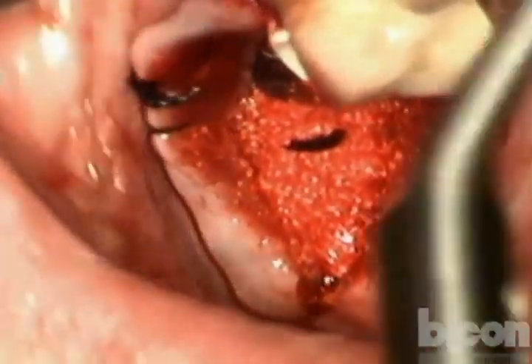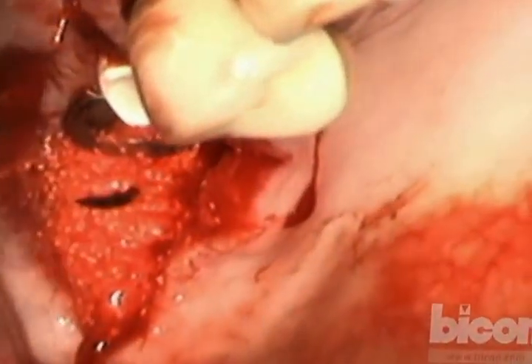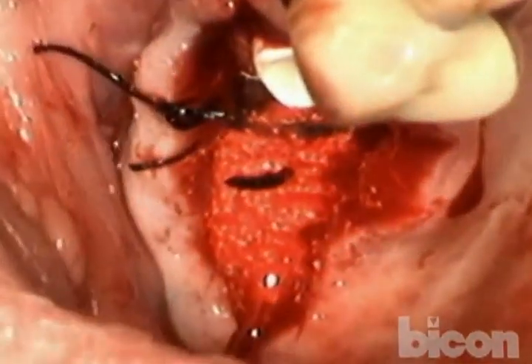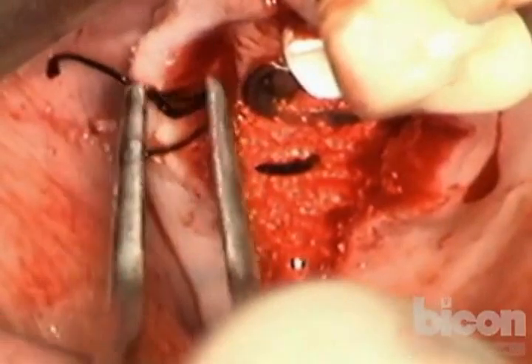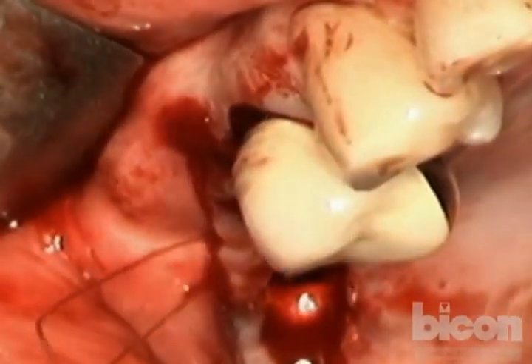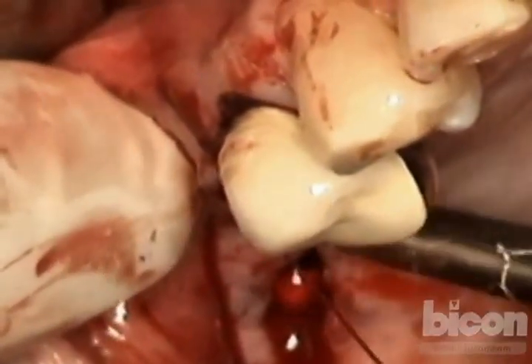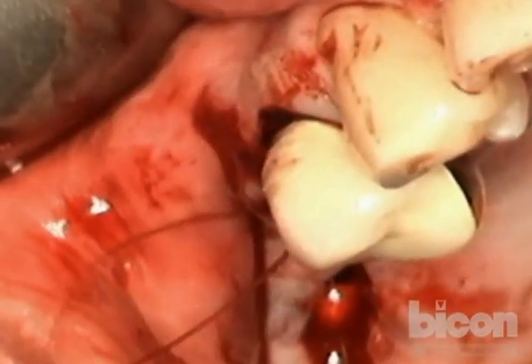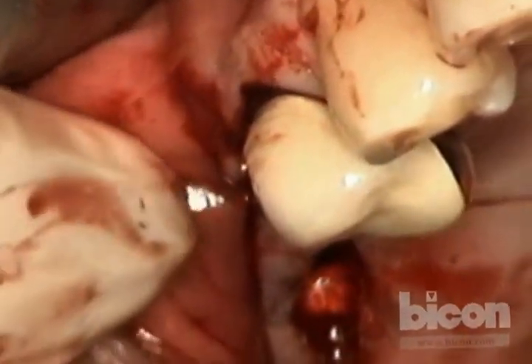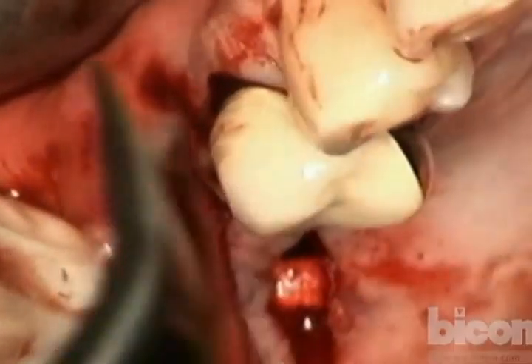And now we'll just release it, okay? Just have you take one final look, chin up a little bit for me, and to the left. Okay? I might try to seat this baby in a little bit more. No, that's good. Let's see how it's going to close over it. Good. I just want to make sure this is still under no tension, because if it is, we'll have to, okay, perfect, suction. We have to release it some more, but we don't have to, because it looks pretty darn good. Alrighty. And we will continue the closure with a continuous horizontal mattress suture.